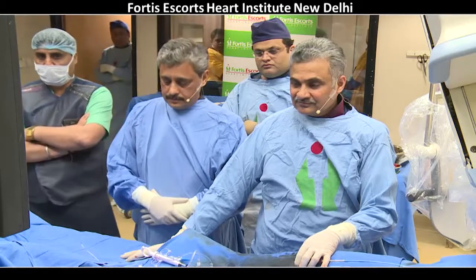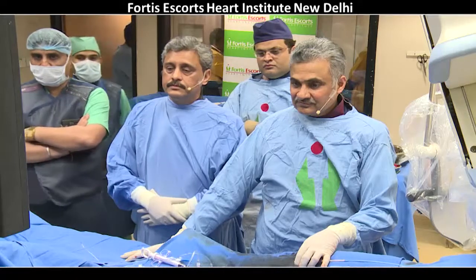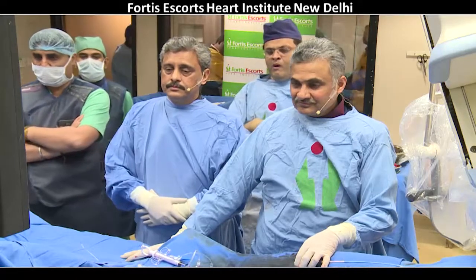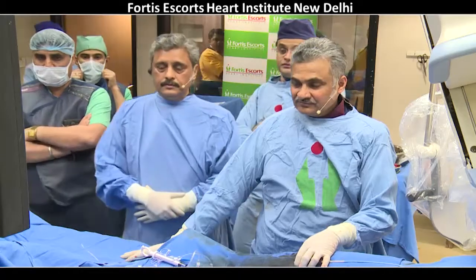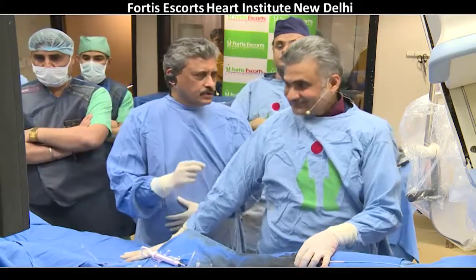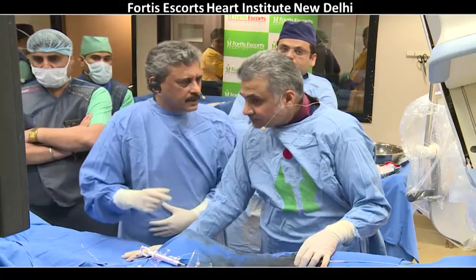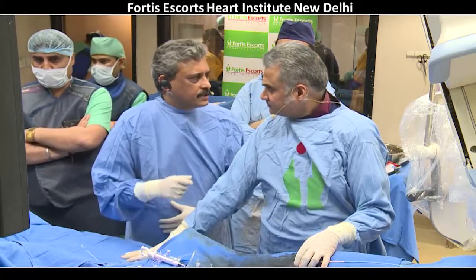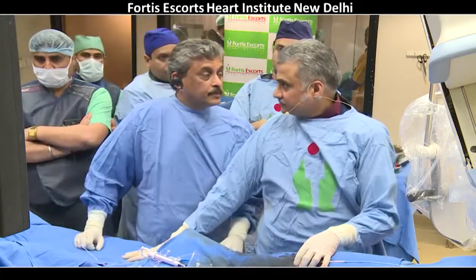We have two of them, the Angiosculpt. We also have the cutting balloon. We also have a third called the chocolate balloon. These are balloons that have some sort of mesh either around them or a constraining mechanism to prevent slipping. They're expensive balloons, and they're not low profile, so I'm not sure it would have crossed in a case like this. Grip balloons are options that we would use.